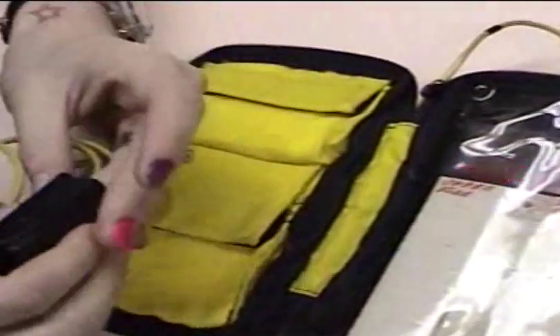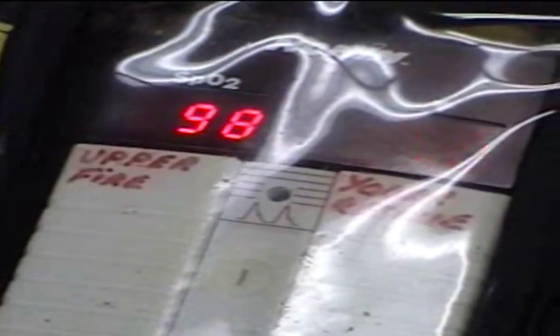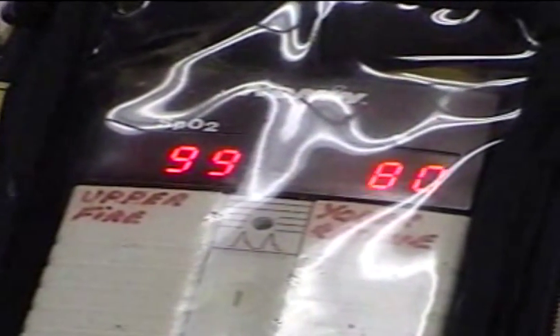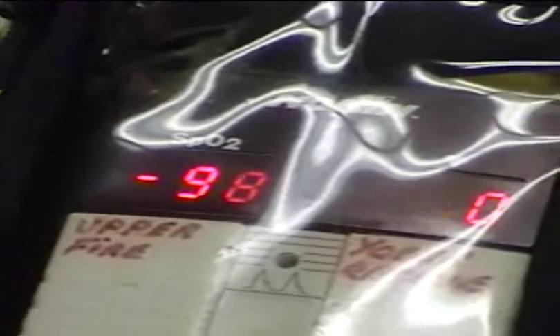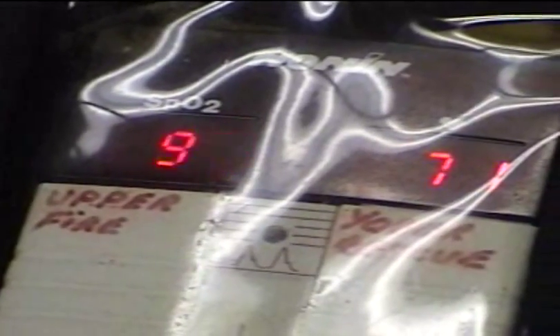Do black — and we got black. It's red — 98%. Pink — 98%, then 99%. This is a purple — and there's our waveform. It's at 99%.